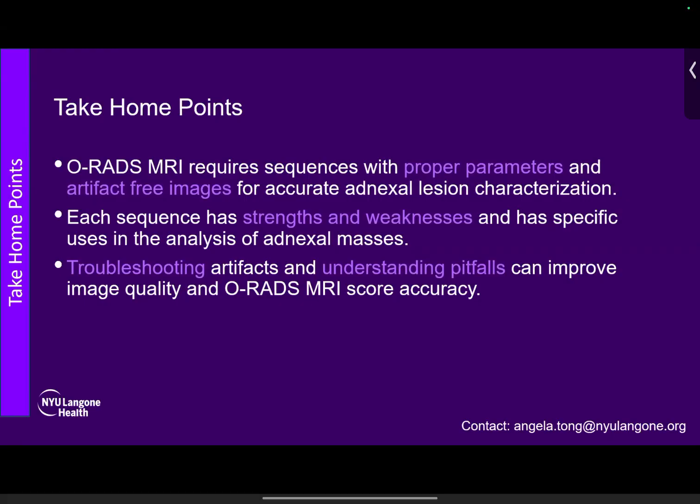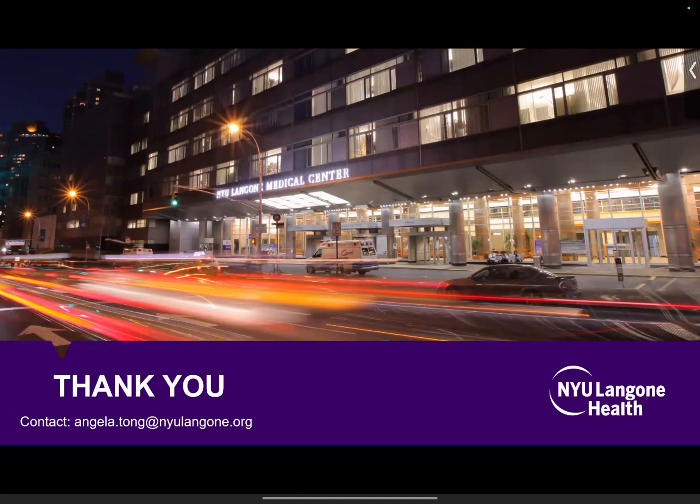It's really robust to artifacts, but DWI and enhancement are better equipped to get the functionality of those adnexal lesions. So you can tell what is enhancing solid tissue, which is important to identify, since those are usually the more worrisome lesions. We also talked a lot about troubleshooting artifacts and understanding pitfalls, and then went over some cases. So I'm happy to take any questions that anyone may have.